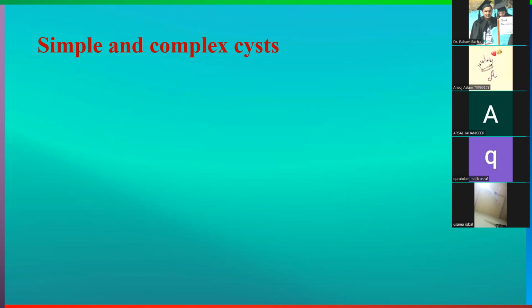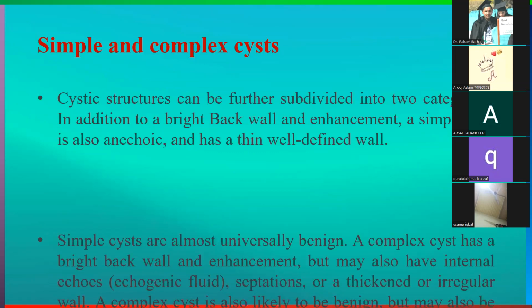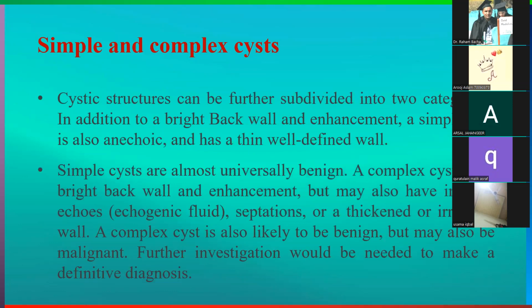Similarly, if any structure appears hypoechoic but renders posterior acoustic shadow, again that will be highly attenuating. Some structures would be like this, hypoechoic by itself and still rendering posterior acoustic shadow, because the structure is highly attenuating. But mostly highly attenuating structures are bright themselves.